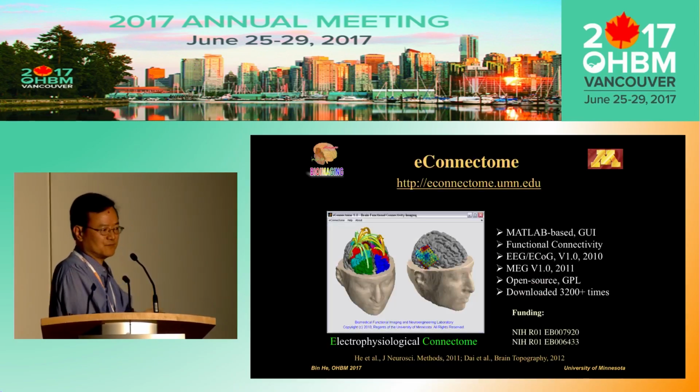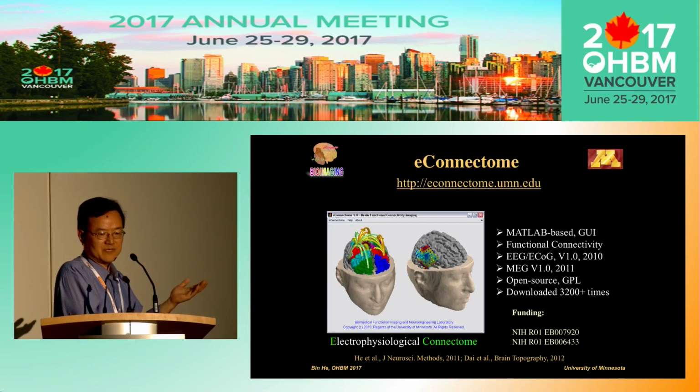And by the way, for any students or colleagues interested, we developed MATLAB-based source code in collaboration with Fabio and Laura, and this is in the public domain. It has had more than 3,000 downloads, and you can share it with others after you download. So every source code is open. You can use this for temporal, spectral, and spatial analysis.